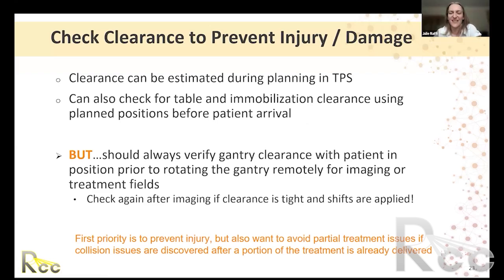Thank you for sharing that. That's an important point too. Not only the gantry rotation around the patient, but if you have other things in the room that could collide as well, you want to make sure that the whole area is clear for the gantry and for the couch if you end up wanting to rotate the treatment table as well. That actually happened at one of our sites too, where one of my colleagues was shorter, and so he'd bring in a little step stool to look at SSDs or alignment. And when the gantry rotated down, it cracked the collimator housing. So this can happen to anybody, anywhere, and it can be really serious for machine repair, if not for patient injury. So thank you for pointing that out.